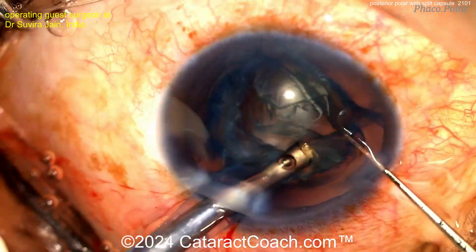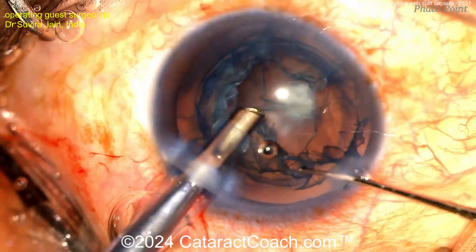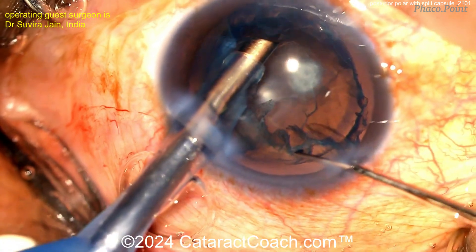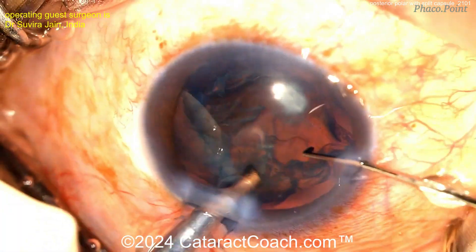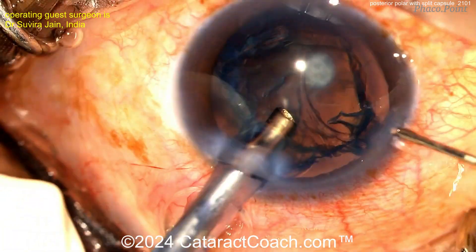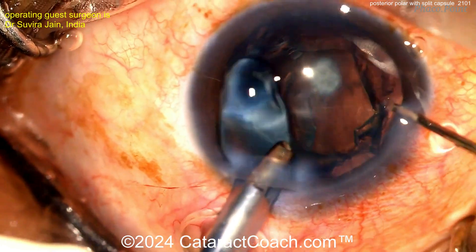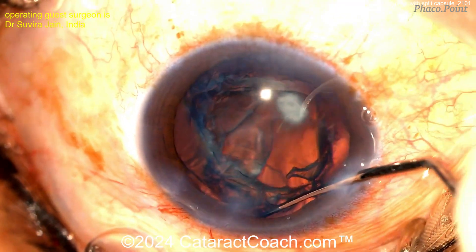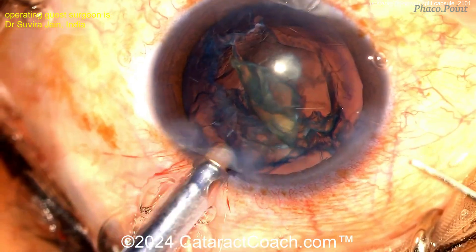You can also try to get as much of the epinucleus as you can. Remember, there's been no hydro dissection done. So now just nice and easy, get as much of it as you can — that looks like a pretty good effort. You can also loosen up some of the subincisional epinucleus shell and cortex here. You can even do a visco dissection, which is the way I preach it. Going in with more viscoelastic — don't let the eye collapse, that's a very smart move. Now going in with our hook or chopper just to dissect away the subincisional epinucleus from the capsule. Beautiful.